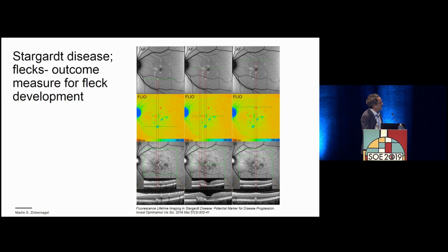And if you look at the OCT and correlate these flecks with OCT findings, you can basically see that these blue flecks are more demarcated. They're more in the area of the retinal pigment epithelium, whereas the red flecks, for example, here, are more of a type of elongated photoreceptors in this area. You can well appreciate that here.